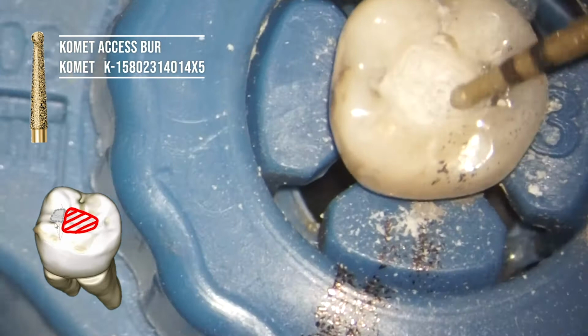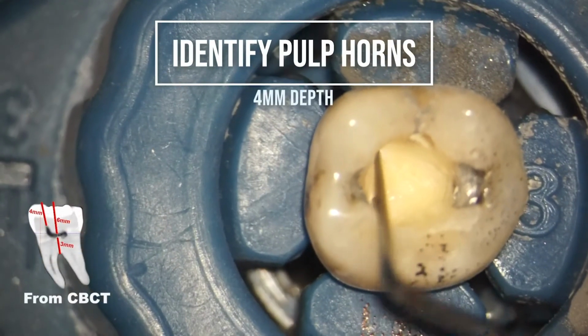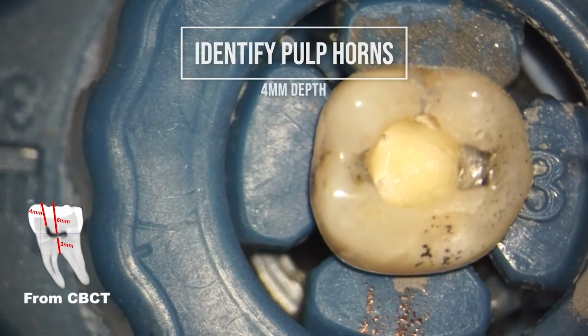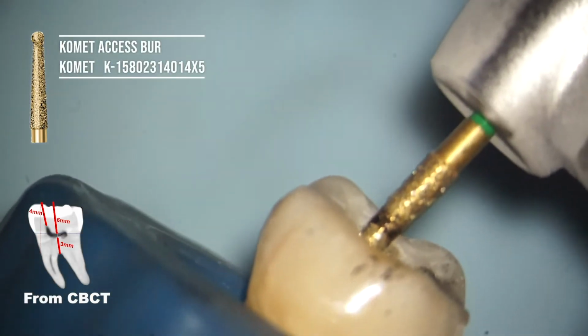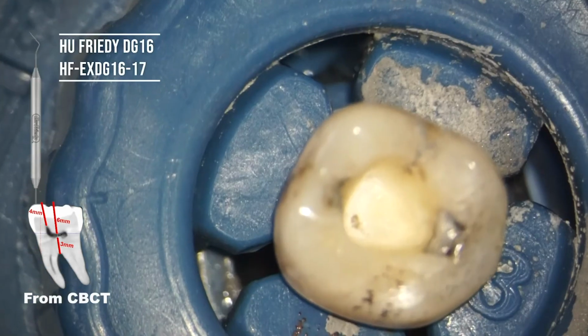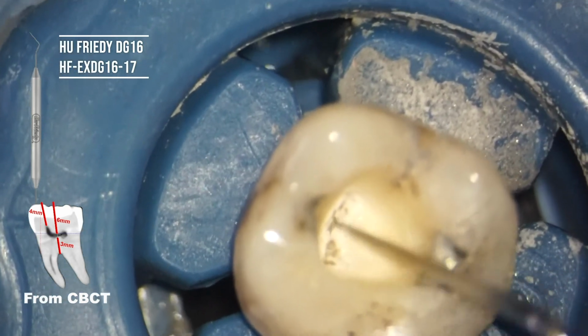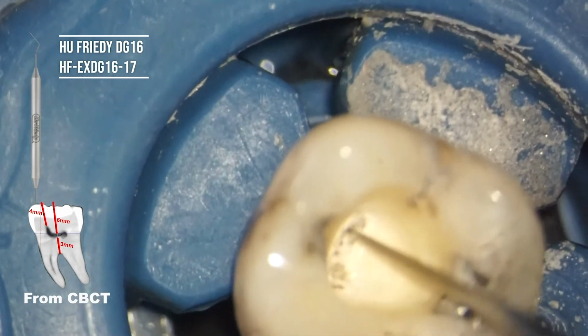Right, at the 4 millimeter mark we can start to see the pulp horns. Sure enough, just a little bit over 4. Now I'm going to take this down to 6, and I should start unroofing the pulp chamber and moving into removing those calcifications. So let's just see if that's what we see. A really sharp DG16 is wonderful for doing this kind of prep, and just scratching away just to confirm and make sure we're on the right path.